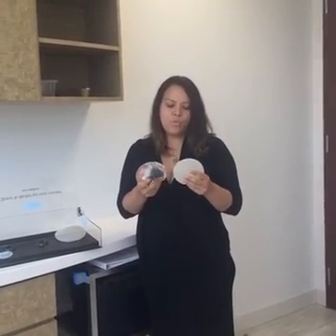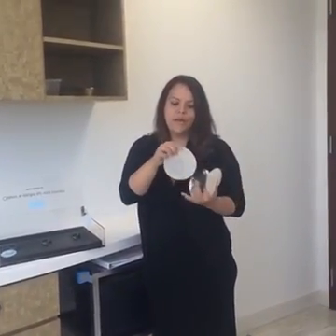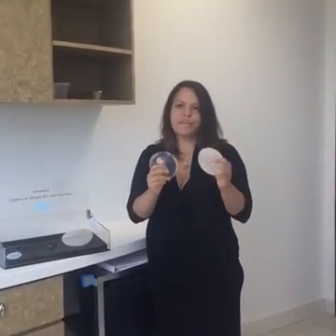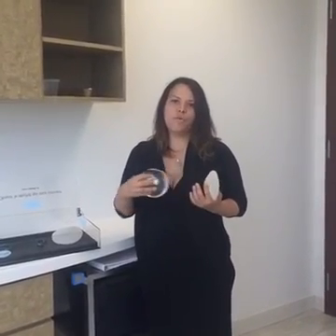And so when we're choosing implants, if you're looking at an anatomic implant, they're almost always textured because we don't want them to rotate and end up upside down. So that makes that decision easy in an anatomic implant. In a smooth implant, there are different reasons to go with smooth or with textured implants for the rounds. A smoother implant will be more mobile, a little bit more squishy. If you want to wear something that's strapless or halter, they'll shift a little bit more with your body, but they can shift a little bit more in the capsule. They're a little bit less likely to stay in place.